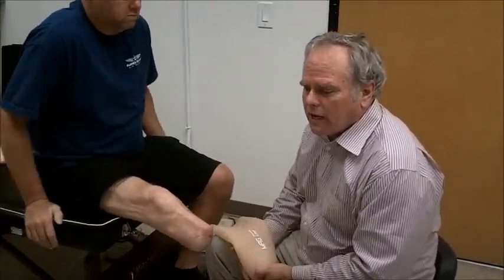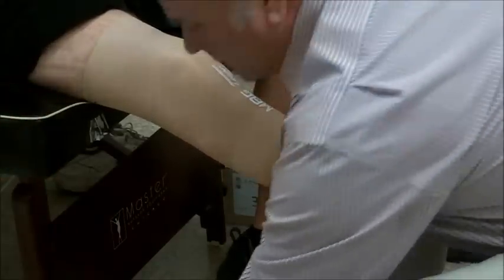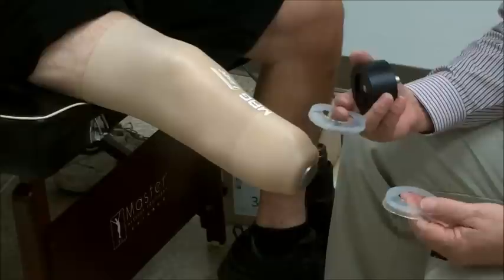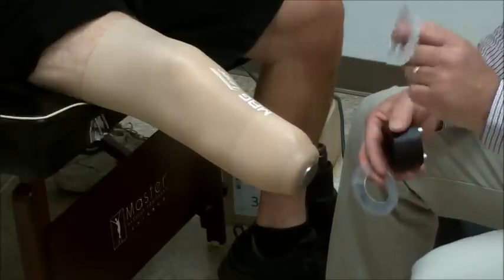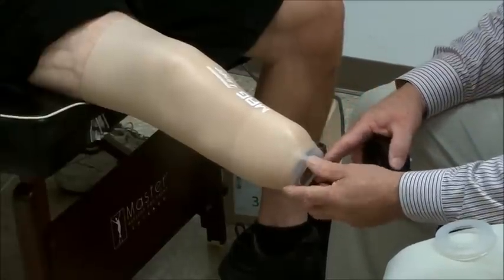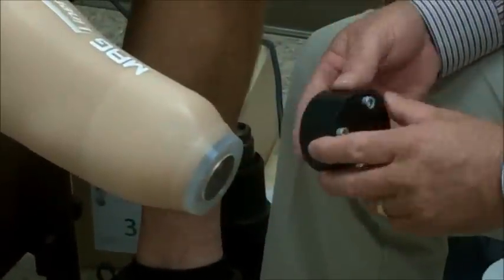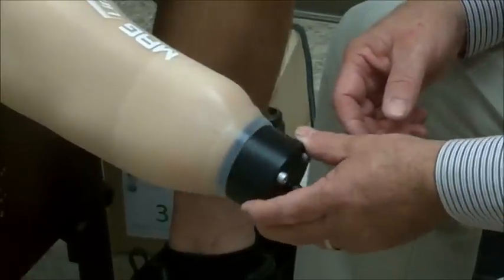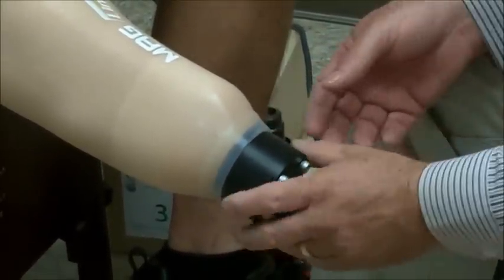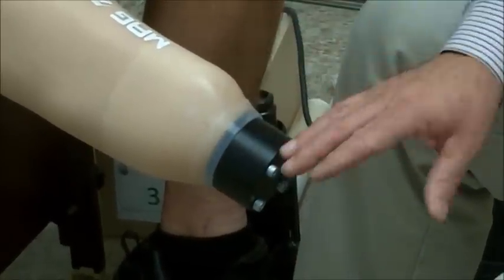I'm going to be demonstrating a new technology called the MagLock. For casting purposes, I'm going to use two fabrication dummies. There's a variety of silicone rings, and that is all about what size the liner is, because there are different sizes of distal caps on these liners. The silicone ring goes on, and then our dummy — originally made for fabrication — works beautifully for casting. The silicone ring makes sure that my cast doesn't get stuck and I don't get my lock stuck in it.